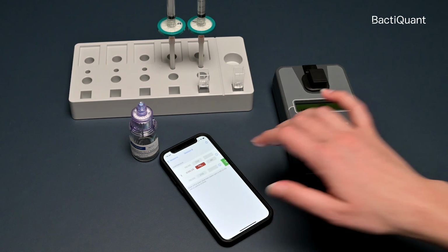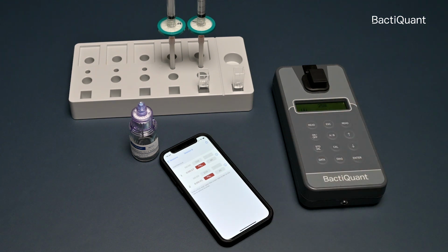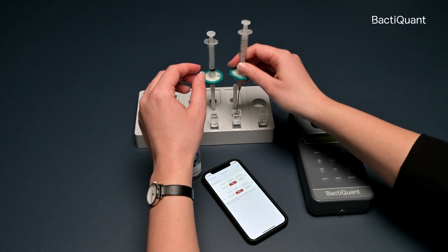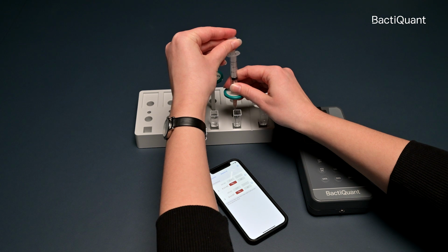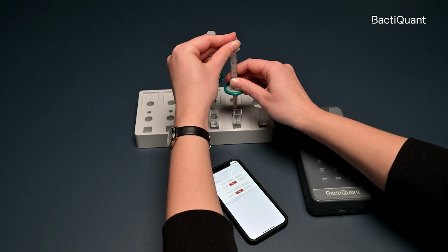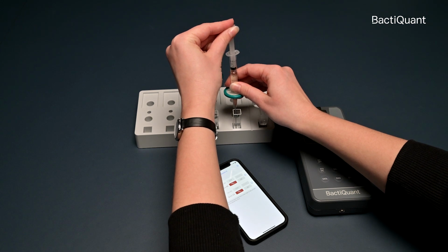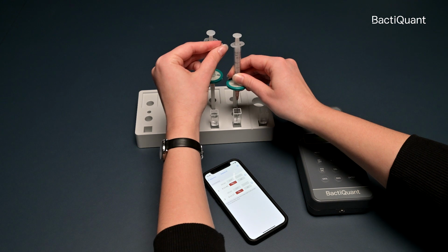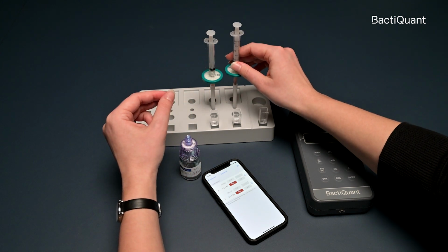Now wait 10 minutes and then make a second reading. Place the filter with the blunt needle in the cuvette and flush back and forth twice. Be careful not to scratch the side of the cuvette. Repeat the mixing for each sample.